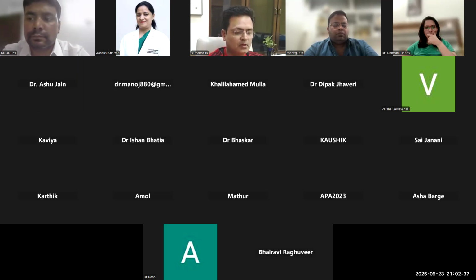Number two, whenever I have a suspicion, I target this specifically. It takes only 2 minutes to do that. If you're doing genicular, then I would do this first and make them walk. If it's not resolved, I go on to do geniculars. If it's resolved, then I don't even think about doing that. Certainly in cases where there is trauma, or where I have a suspicion about this being involved, I do that as a routine, as a part of my protocol.